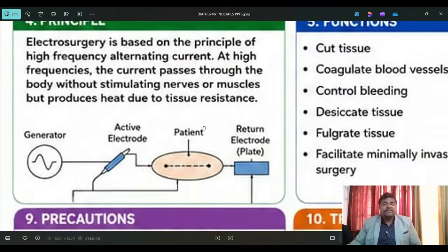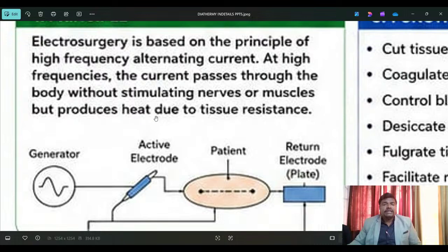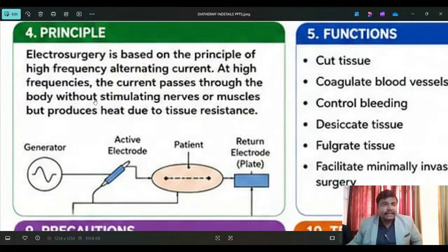Next, diathermy. I brought a very clear picture for you. My focus is that every single point should not be missed, because every piece of information is very, very important. That's why I'm giving you point-wise, and every point should be covered. Then only can you operate the equipment and repair it. And if any equipment problem comes, how to check it, I will share with you right now.